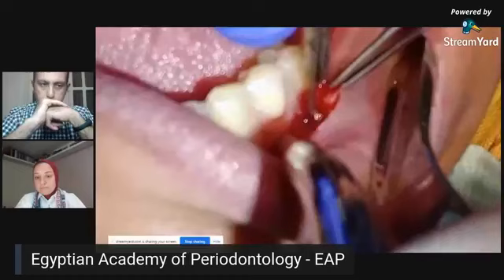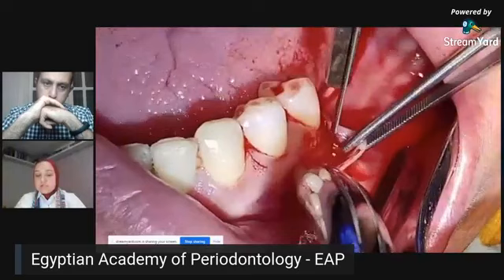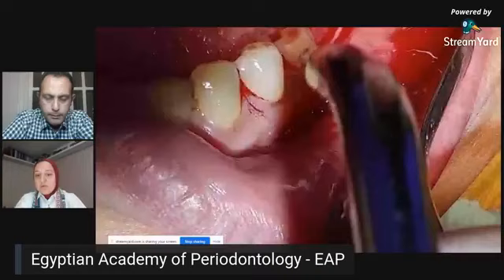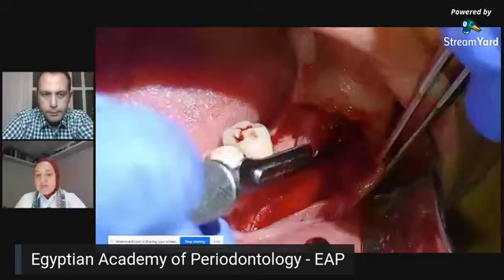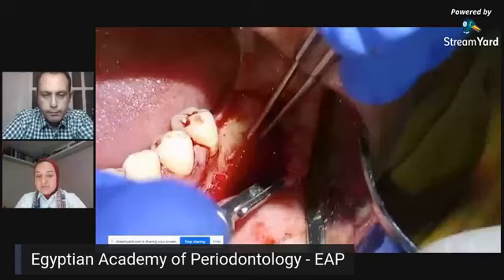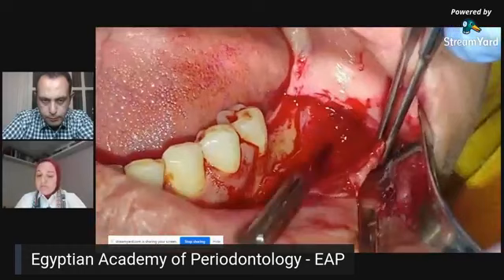It will not be taking long. Of course, you have to be very careful with this splitting and you have to continuously hydrate your tissues so that it doesn't crack or no perforations occur while doing this split thickness. And now, as you can see in the video, we have the outer mucosal layer that I'm holding with the tissue forceps and the inner periosteal layer, which is still attached to the bone. You can see this is the inner periosteal layer and this is the outer mucosal layer. This technique guarantees that the periosteum is intact and that the blood supply to the flap is less compromised.